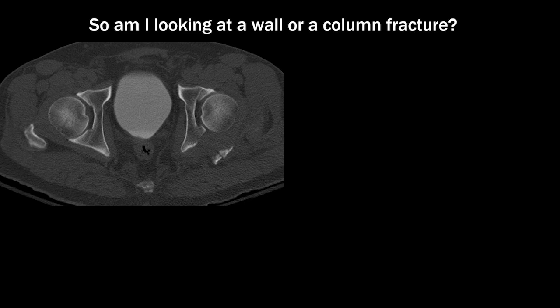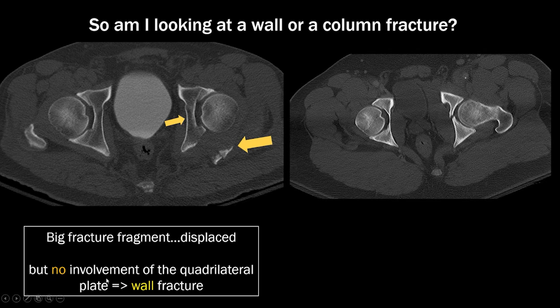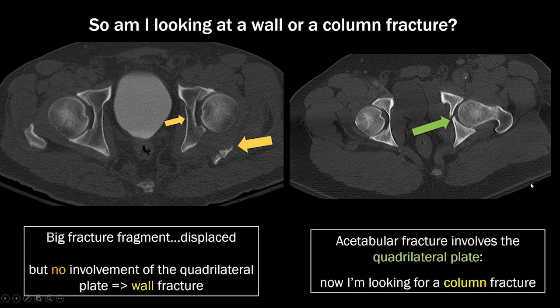Let's practice. In this patient, there's a comminuted acetabular fracture with fragments at the back. Scrolling up and down, the quadrilateral plate is intact — so this is a wall fracture. Unlike this patient, where there's a fracture clearly involving the quadrilateral plate at the medial wall of the acetabulum — since it involves the quadrilateral plate, we know we're looking for a column fracture.